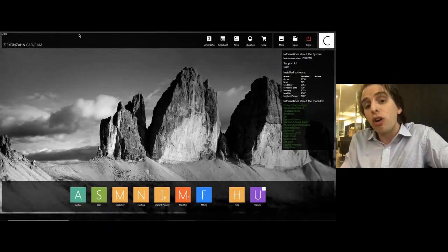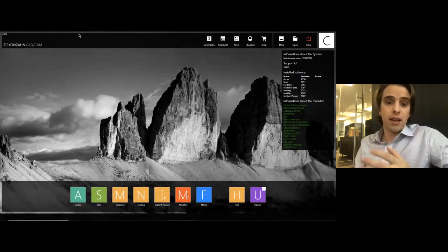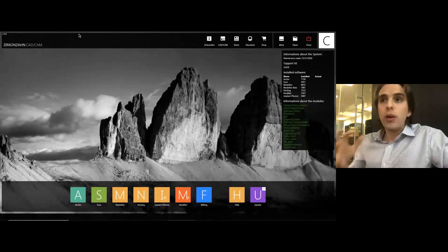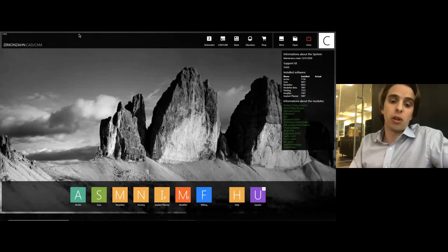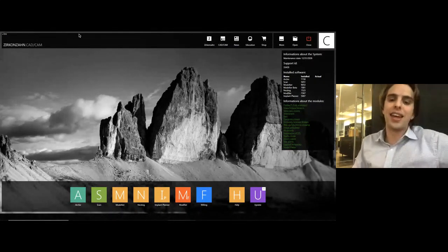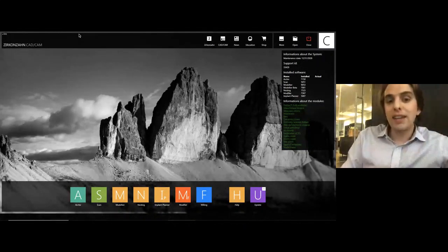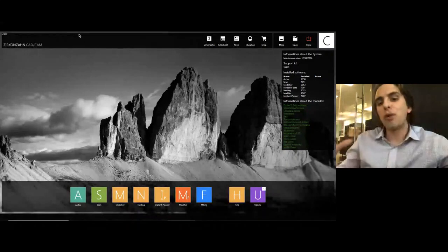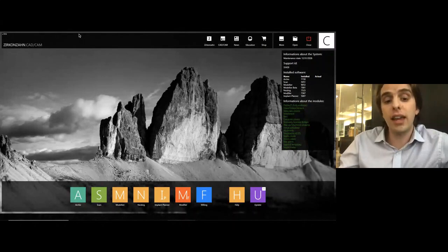And once we have our setup established and tested out on an articulator, whether it's an analog or a virtual articulator, we have to take this wax up through the final fabrication of the dental appliance, whether that's through a casting or an investment technique, or if we're in a digital world, we take that through the nesting and the milling software. So you see, all of a sudden, that magnificent case I showed you at the very beginning, we start to unravel all of the steps that were required to achieve the end result.